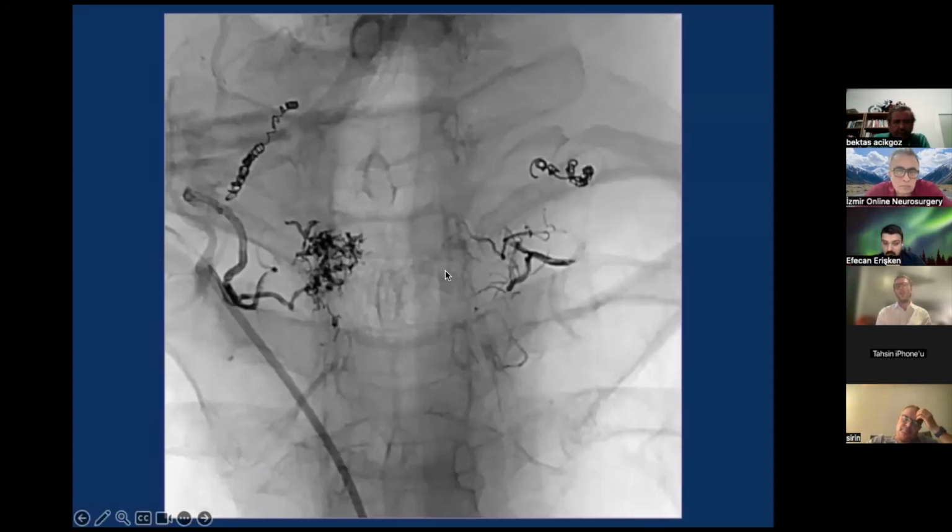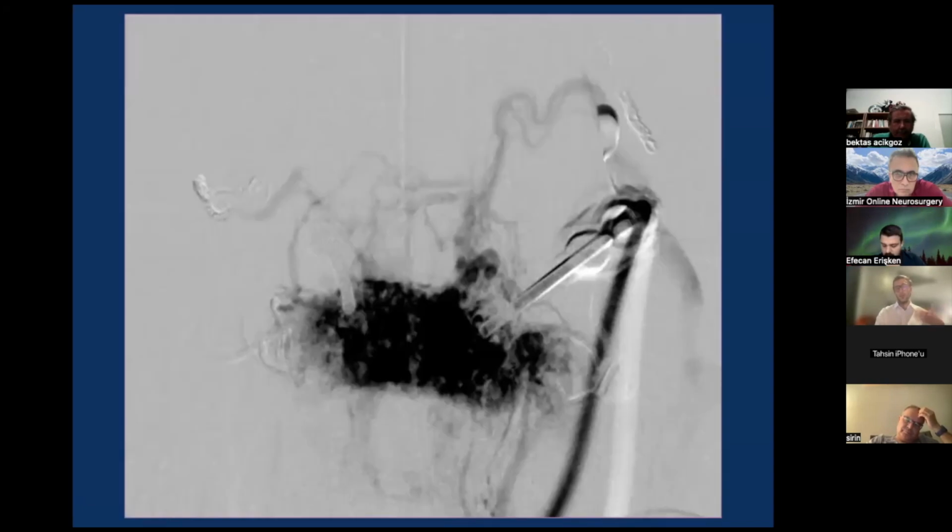right side. So we devascularized the T2 vertebral body to avoid the reflux while injecting the alcohol through the bone needle. And so we performed once more the sclerosis with alcohol a second time, and here you have the bone needle in place, and when you do the phlebography, you don't see anymore the reflux in the supreme intercostal artery because we occluded all these vessels by intra-arterial route.